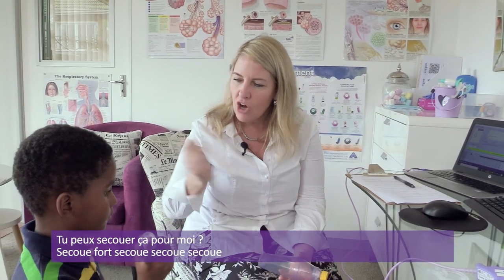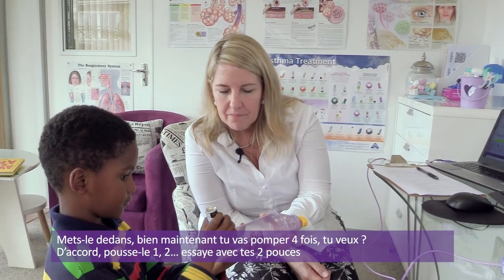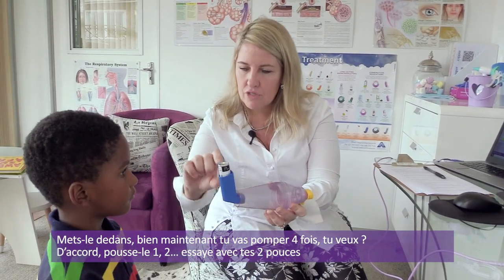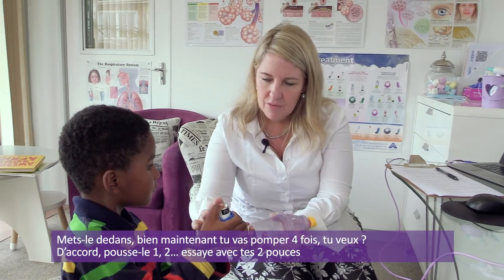Do you want to shake this for me? Can you shake that up for me? Shake it hard. Good boy. Okay, put it in here. Good. Okay, now what you can do is you can spray it four times. Do you want to spray this? Okay, spray it.